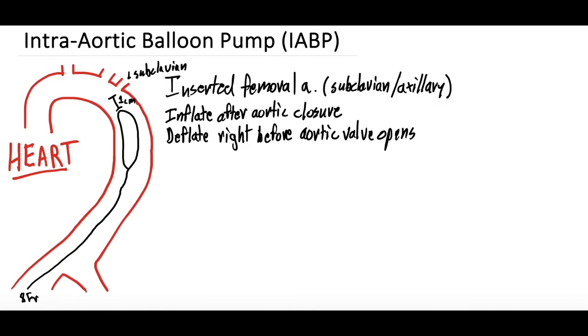So why is that? To understand this, I'm going to draw an arterial line waveform, which typically looks like this. What are the parts of this waveform? Here, this upstroke is the systolic upstroke. An arterial line goes in the artery and measures the arterial blood pressure, and it creates a wave based on that arterial blood pressure.